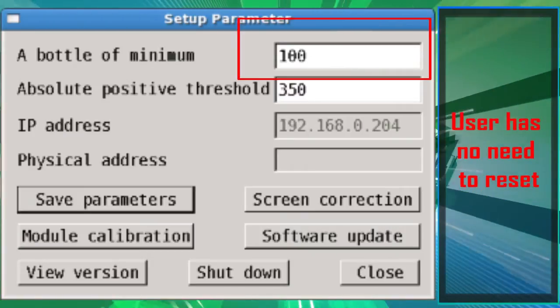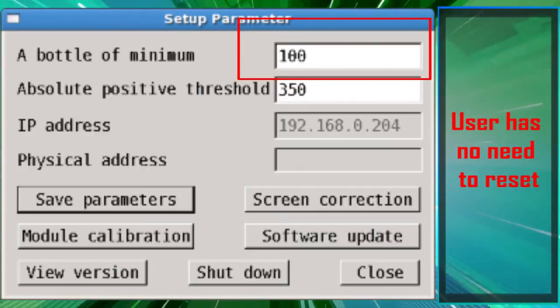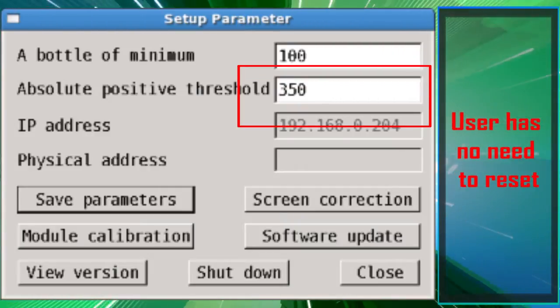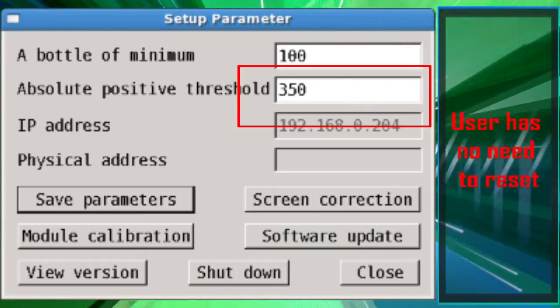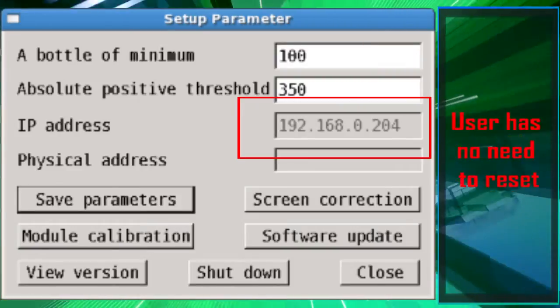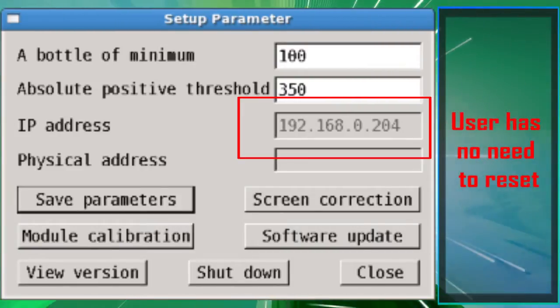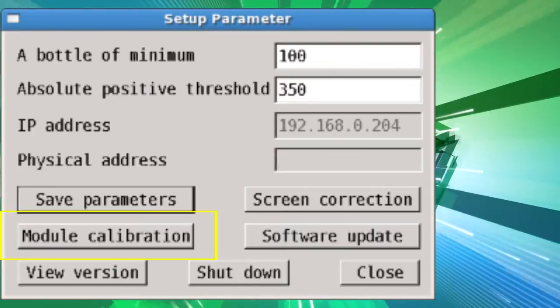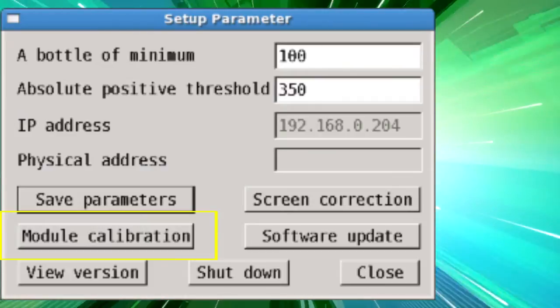System settings: The default value for Min Bottle Value is 100 — users do not need to reset this. The default value for Absolute Positive Threshold is 350 — users do not need to reset this. IP Address and Physical Address are set initially and do not need to be reset. Module Calibration mode is set by qualified technicians only.